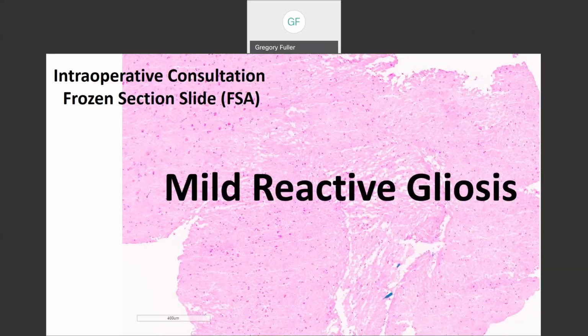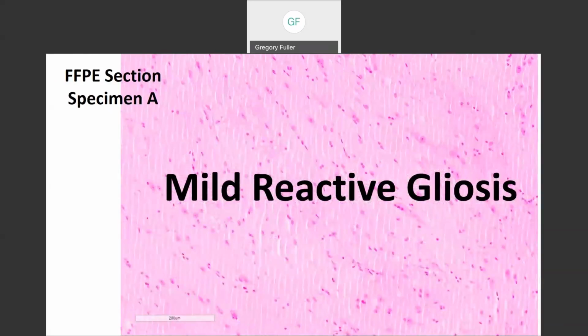Just barely gliosis. So what is going on? Whoa, it's interesting, isn't it? Yeah, there's a higher power. You can see there's gray matter here, neurons, neuropil, et cetera, nothing going on. Ki-67, maybe one nucleus. No other tumor markers, P53, nothing labeling, okay?